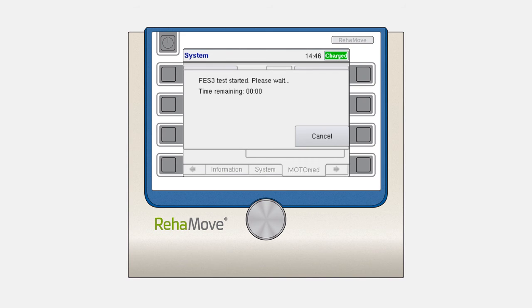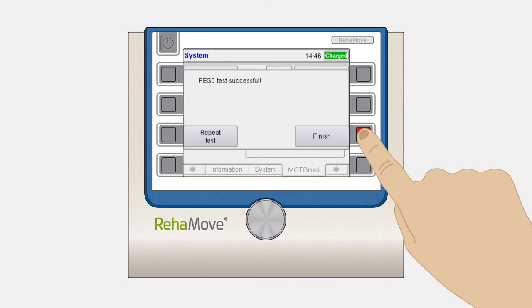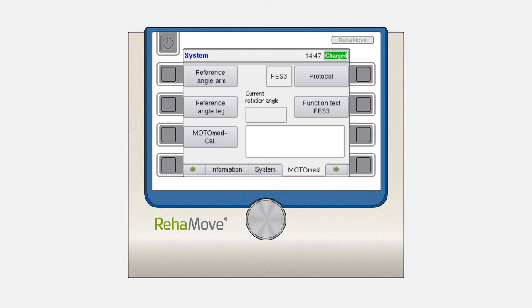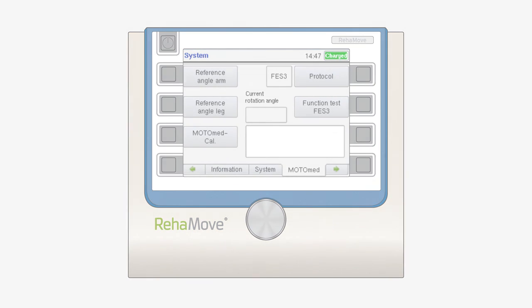If there are any issues, a pop-up window hints at how you can solve them.